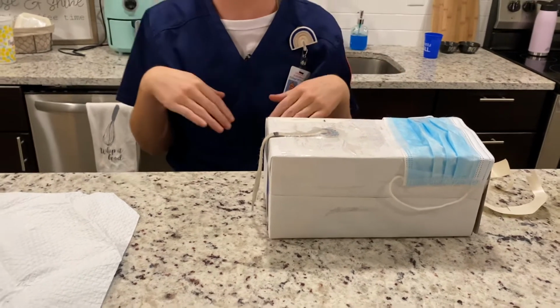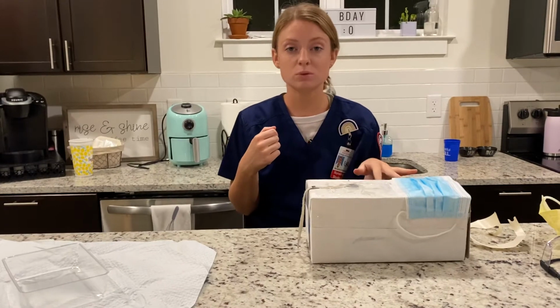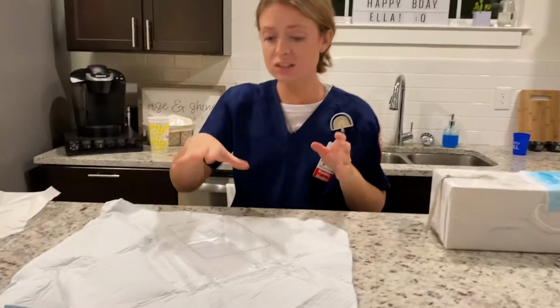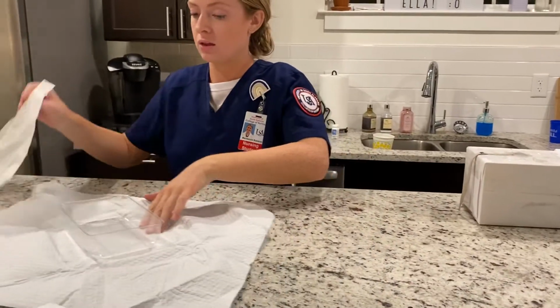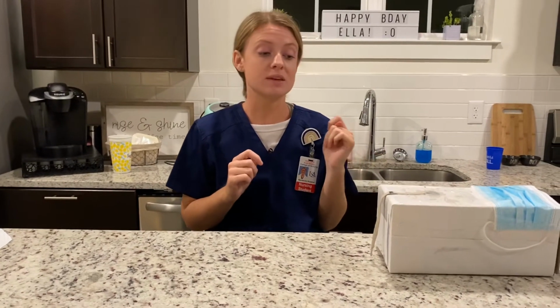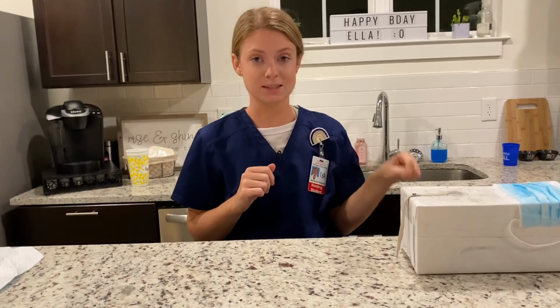So now I'm going to lower the bed to the lowest level, raise the side rails, and make sure the patient's comfortable with the call light in reach. And so now I'm going to dispose of all my equipment, and I'll perform hand hygiene, and I'm going to document. I will document the appearance of the site, the amount and characteristics of the drainage, if a wound culture was obtained, the type of cleanser, the type of dressing, the patient's tolerance, and the date and time, and my signature. Thank you.